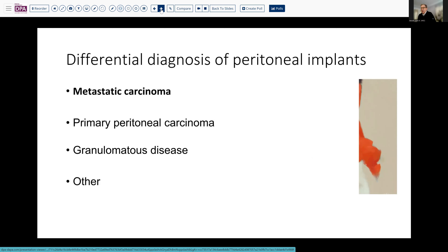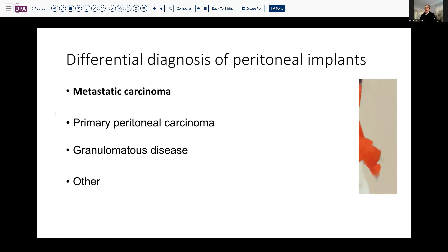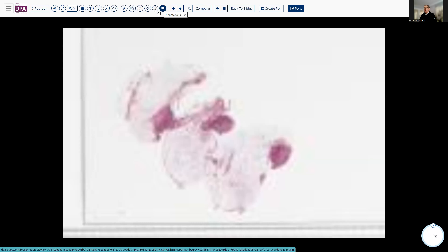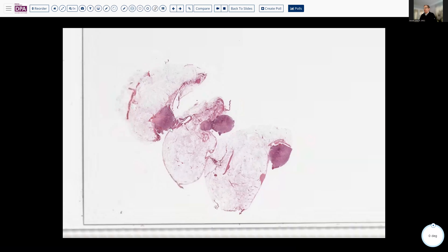Additionally, we've seen cases where granulomatous disease has very closely mimicked metastatic malignancy and created a concern. In addition, there are a few other entities that enter the consideration as well — foreign body, which would usually fall under granulomatous disease — as well as some benign entities. So let's take a look at the tissue in this patient.